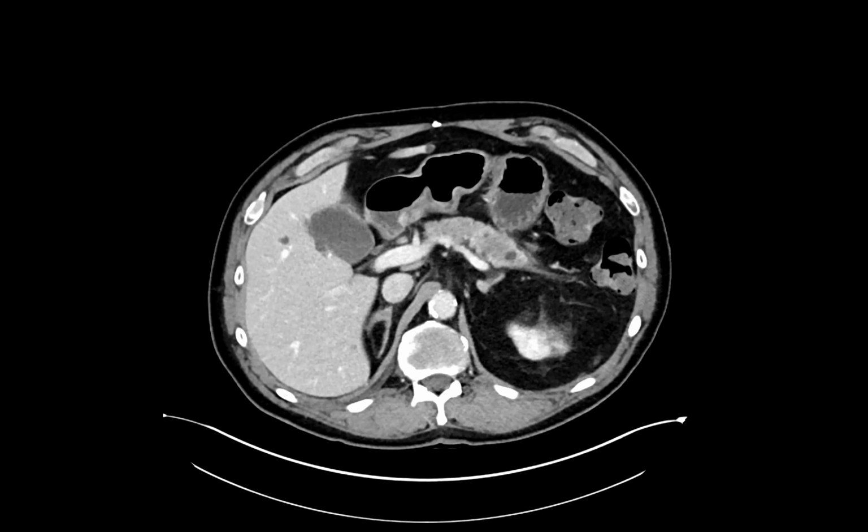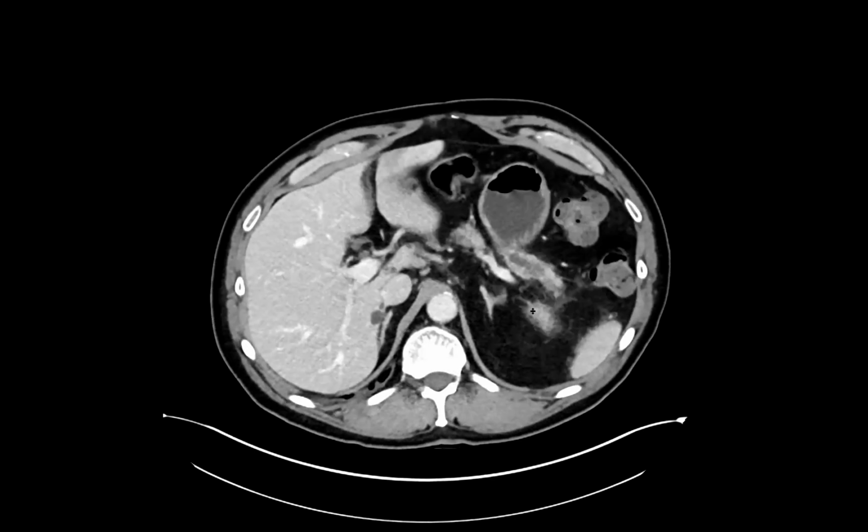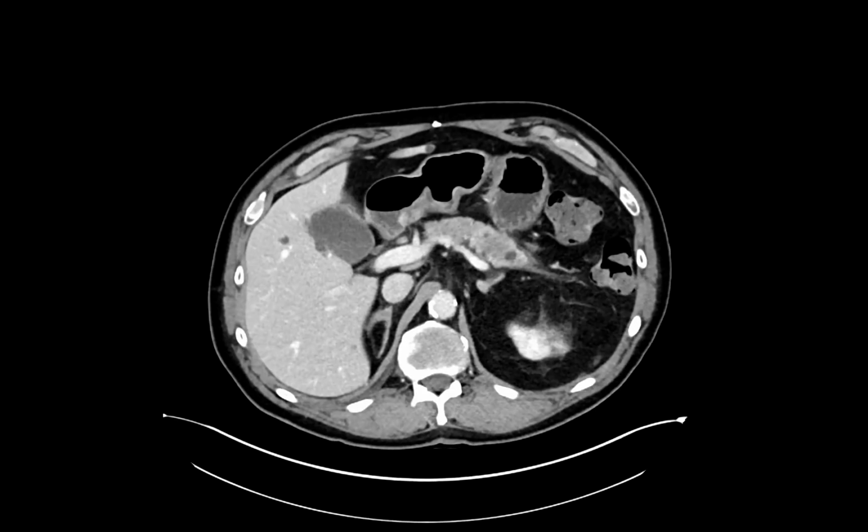When I look at non-contrasted imaging and I go through the checklist of organs, that's one of the things that I try hard to look at: the pancreas. Can I see the duct or not? And if so, does it look abnormal, ectatic, cutoff signs? I've seen them before like this. And so scary. Yeah, you don't want to get burned. So look for the duct even on an uncon. Huh. It's a good way. I'll add that to my checklist.